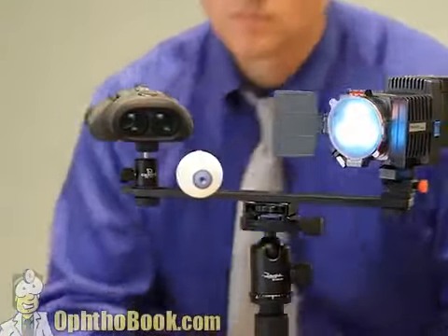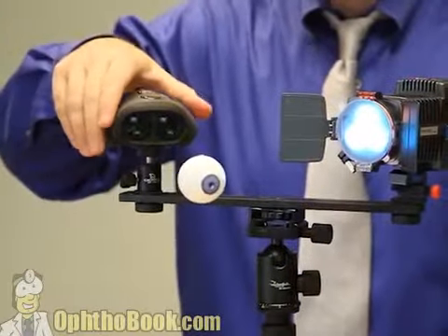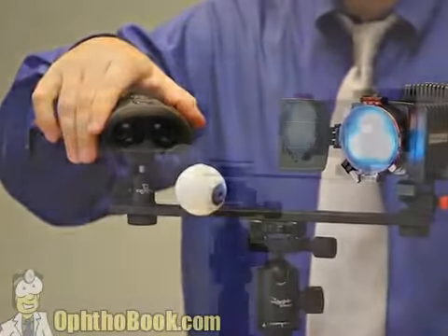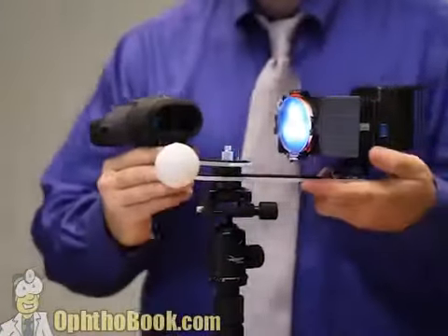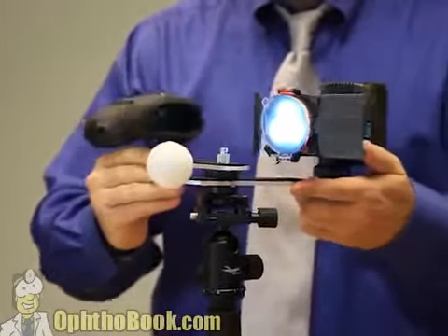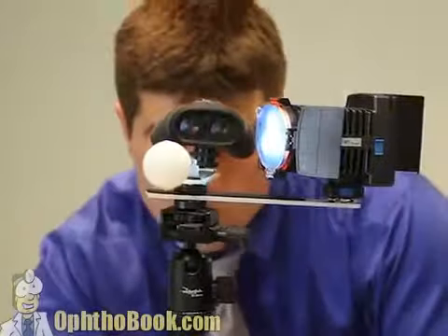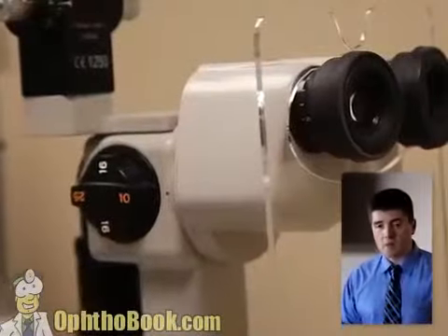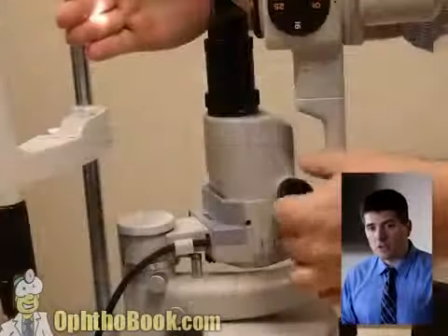Now, the last thing we need to do is right now our light is stuck. It can't move in relationship to our microscope. But what if we created some type of hinge mechanism so that we could move the light in relation to our scope and they still be in focus at the same point? This is basically the perfect modern microscope. And if we look at a modern microscope, this is exactly what we see. There's a microscopic component to it.